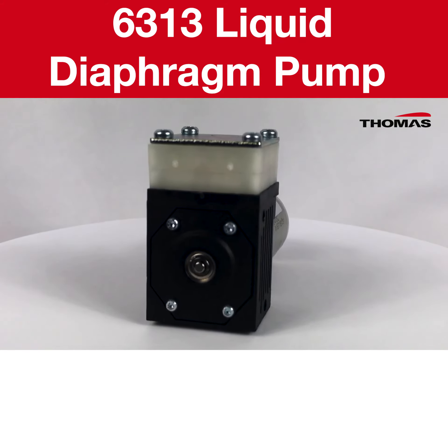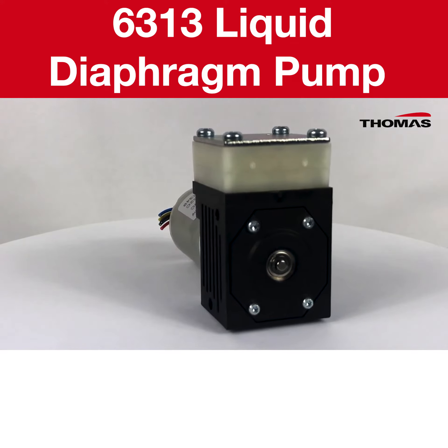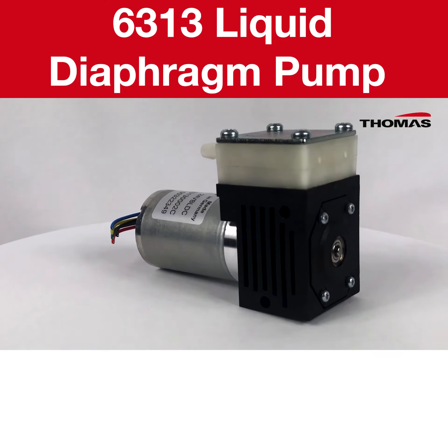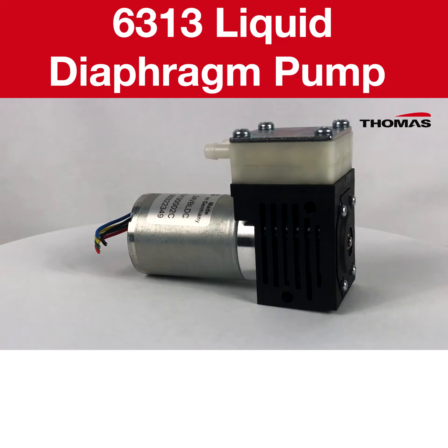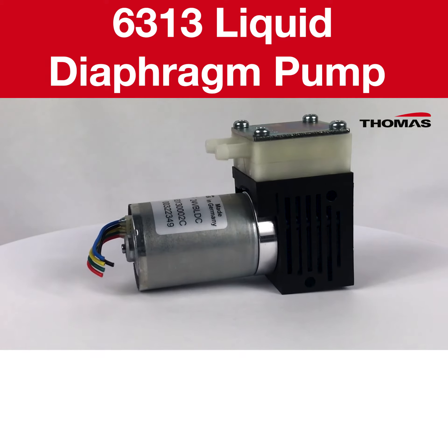In automated analytical equipment it is important to remove sample liquids and reagents after each test to prepare the system for the next test. It is very important to ensure fast and thorough removal of these liquids to keep sample throughput high whilst avoiding cross-contamination.